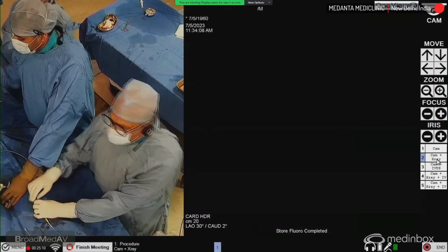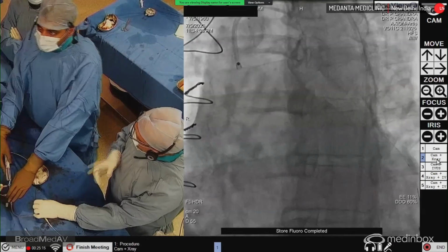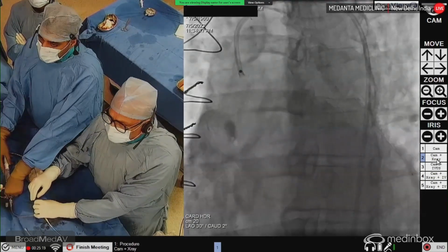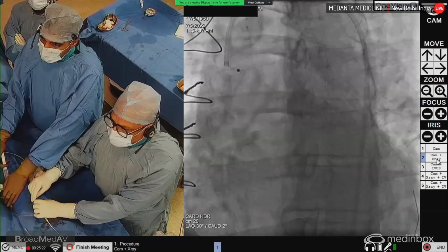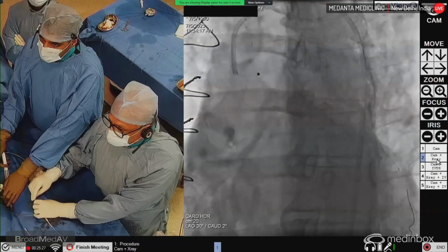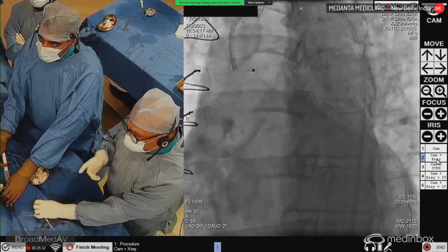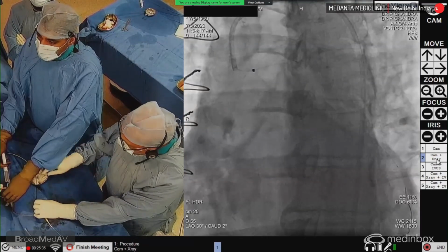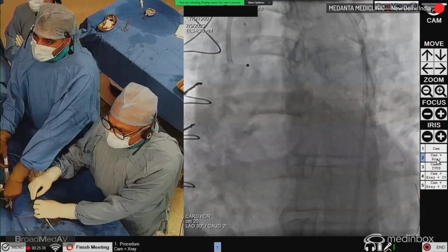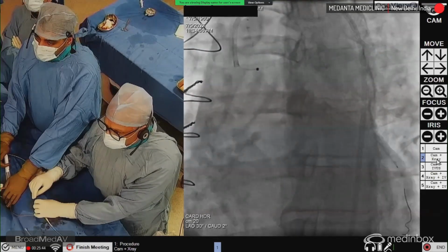So I'm doing these short runs with this 1.4. Normally I use a 0.9 catheter for native coronary circulation, but this is a big vessel. And in here I'm choosing a 1.4. Actually, I was having a discussion with Dr. Samir Mehta, who has done hundreds of these cases. And he published in 1992-93 about these laser and vein grafts. So his observation was also that we should take a bigger catheter and not too many passes. But now we will see how things move here. Okay, flushing on.